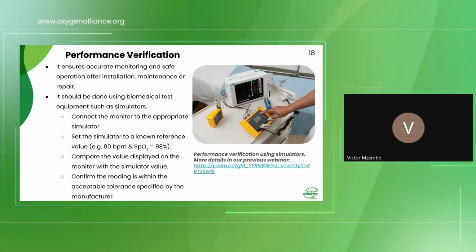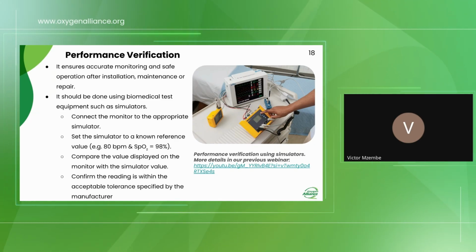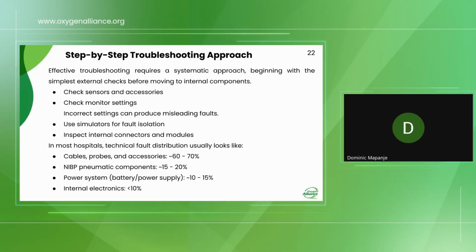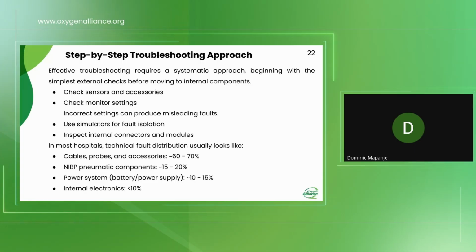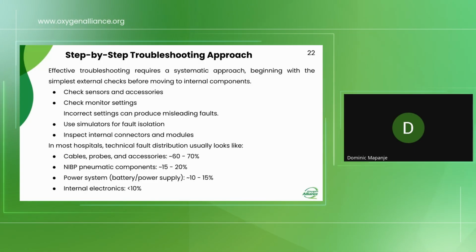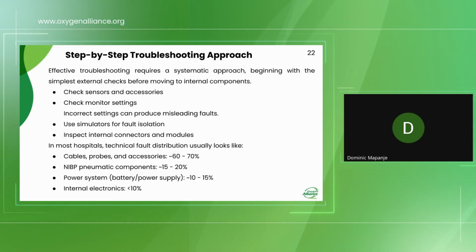And this is the rapid event with Dominic Mapanje. Yeah, sure. So I'm Dominic Mapanje, a program officer for OpenO2. I'll be taking you through the common faults that are found with patient monitors and how we can troubleshoot these common faults.